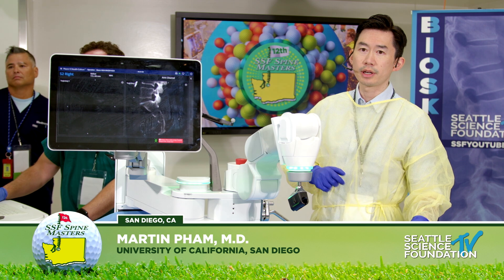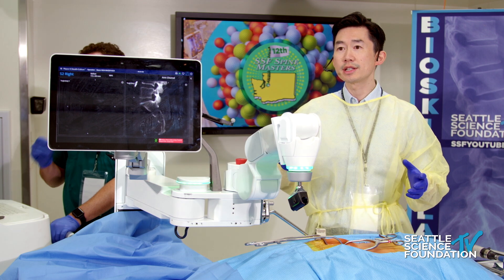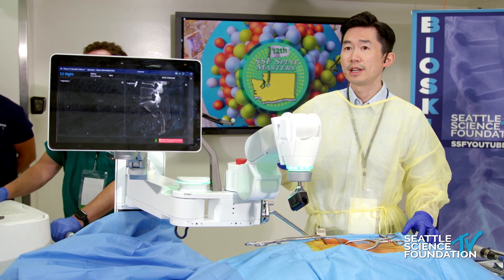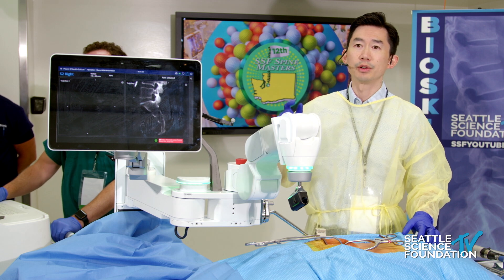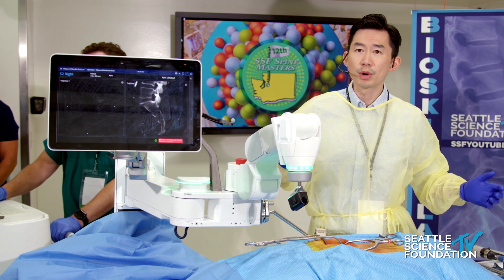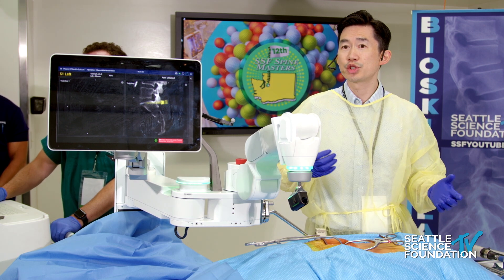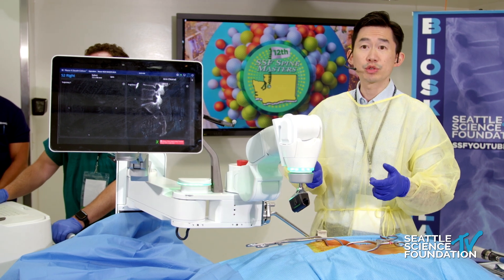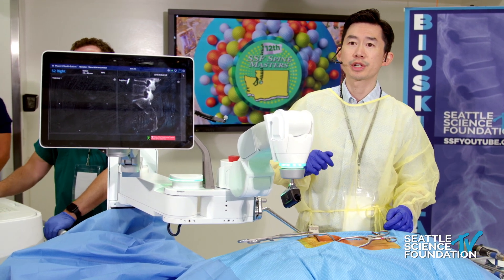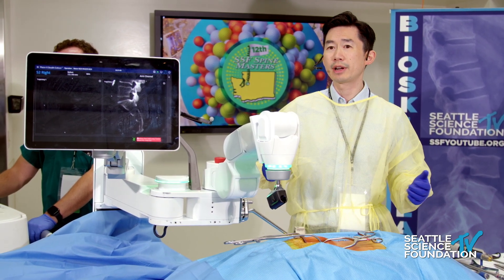For this demonstration, we'll be demonstrating S2 ALI iliac screw placement, especially in the setting of deformity. For the trainees or younger surgeons on this call, you may not remember a time when placement of S2 ALI iliac screws was quite difficult. I've placed them freehand, under fluoro assist, under nav — there was a time this was actually quite difficult. Now with robotic systems, this becomes like another mundane screw, as it should be, because as the foundation for your deformity correction it should be straightforward. You shouldn't be troubleshooting or repositioning — this should be the perfect screw the first time around.